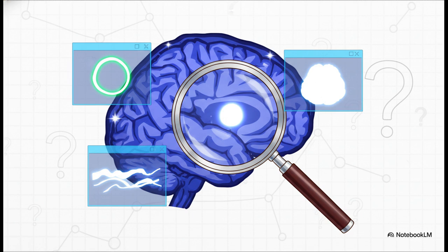Does it have that classic ring enhancement of an abscess? Is the T2 signal just bizarre, like in CJD or herpes? Is it a solid enhancing mass like lymphoma? You have to put on your detective hat.